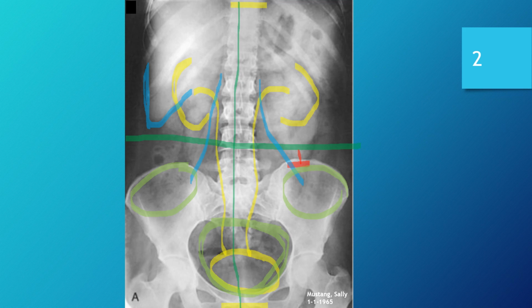But, okay, so is it free from external artifacts? Yes. Internal artifacts, just the bowel gas. But as we know, there's nothing we can really do about that, but we must make note of it. Okay. And finally, does the image demonstrate appropriate reference information? Well, there's an object here that is not a true anatomical marker. I'm not sure what that was supposed to indicate, but it does not help us as far as reference information for this exam.